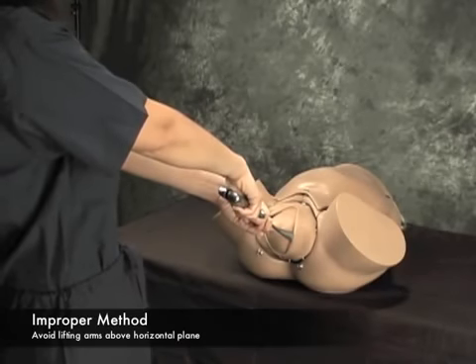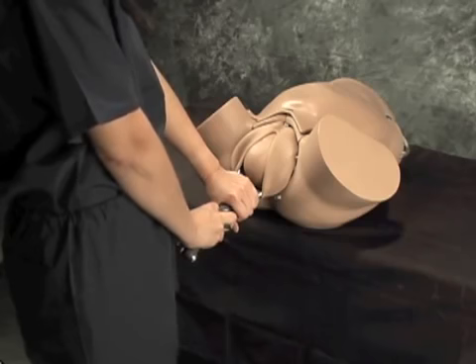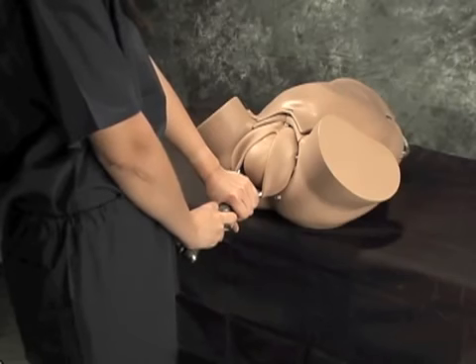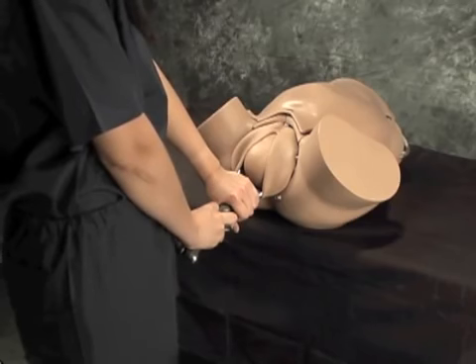Avoid extending your arms. Instead, keep an erect posture with both feet planted well on the ground, keeping elbows close to the sides, using only arm and shoulder muscles. Apply steady pull in conjunction with uterine contraction and maternal pushing.